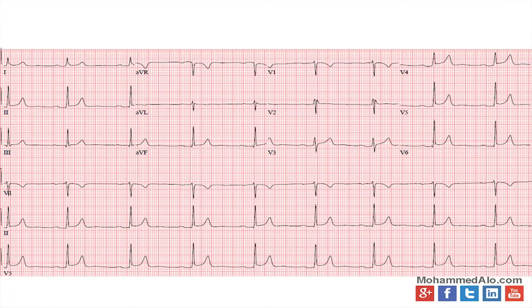Next EKG, what do you see here? You see some ST elevations in V4, V5, V6. You see quite a prolonged PR interval. If you look at lead 3, the second P wave there is longer than a large box. It puts you at a prolonged PR interval.